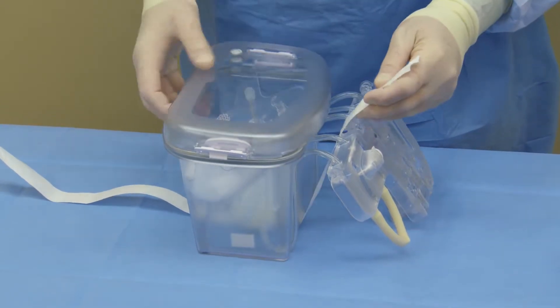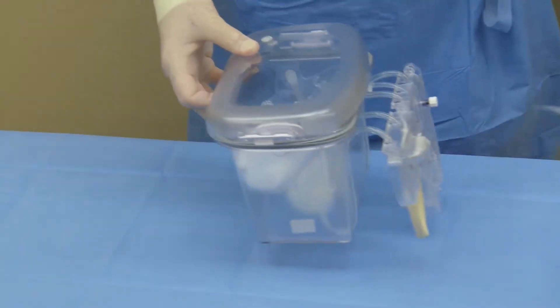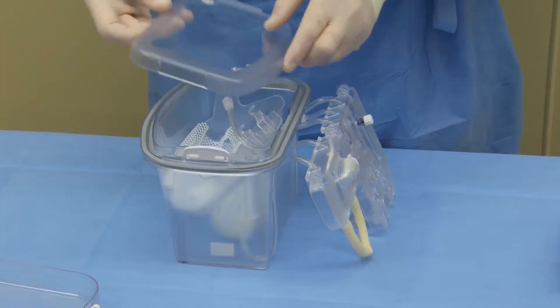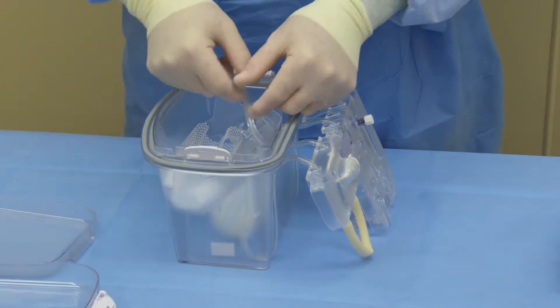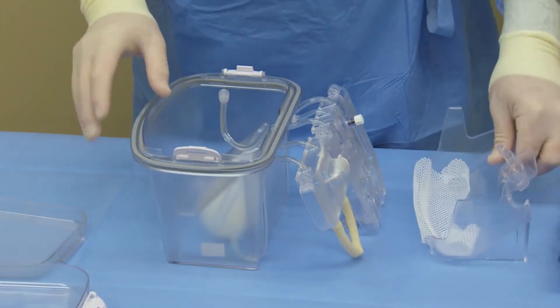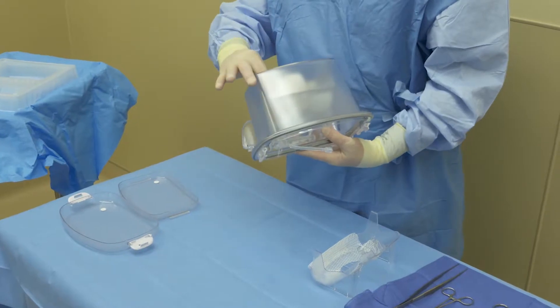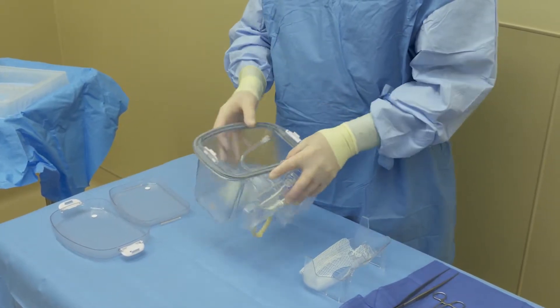Remove the paper tape securing the inner and outer lids to the perfusion circuit. Remove the inner organ cradle. At this time, perform an inspection of the perfusion circuit. Ensure nothing is cracked, broken, etc.